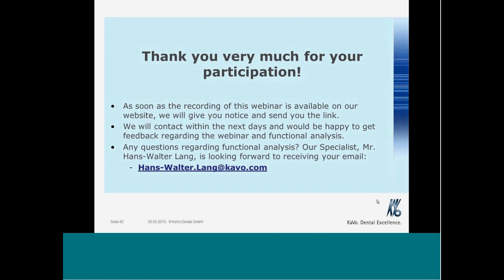Okay. Question is, which position to do the registration? I always prefer the patient in a most upright sitting position. Why? That's, let's say, a physiological position when you are awake. And when you are awake, you will use your teeth for chewing and for speaking and so on. That means it's, in my opinion, the most physiological position to adjust the centric relation.